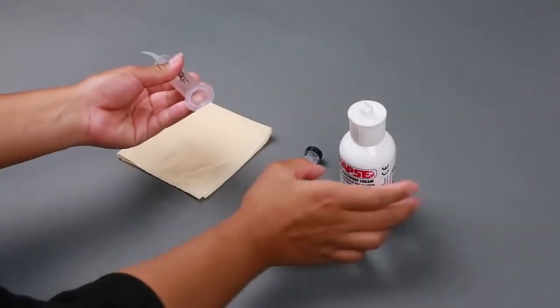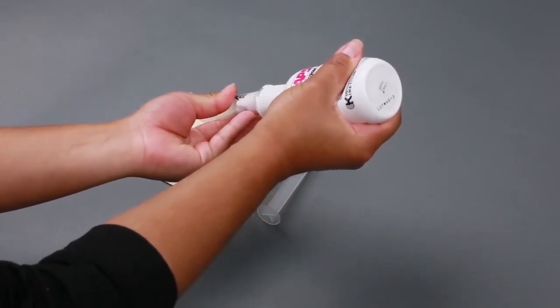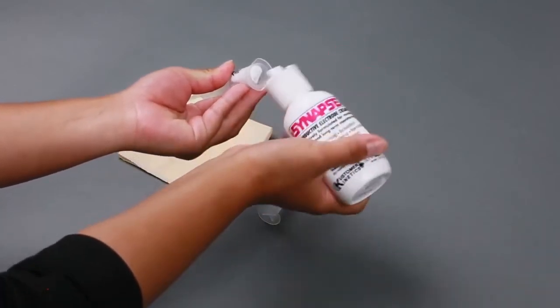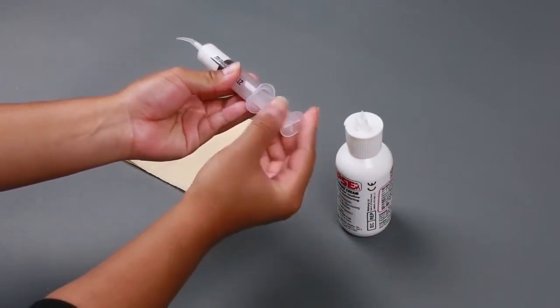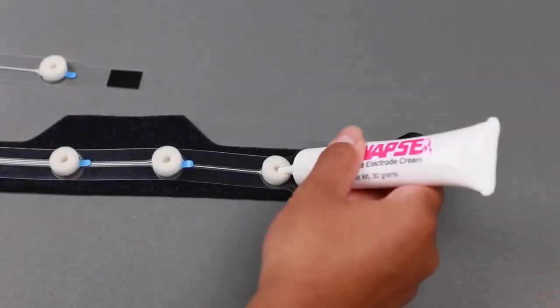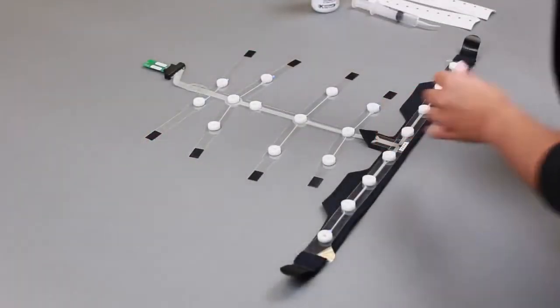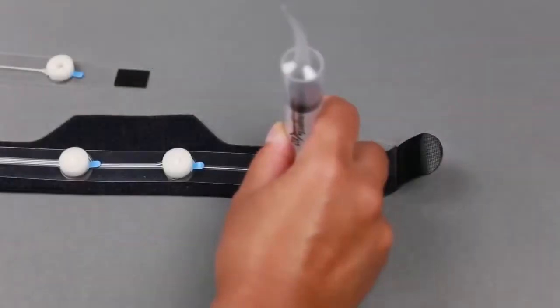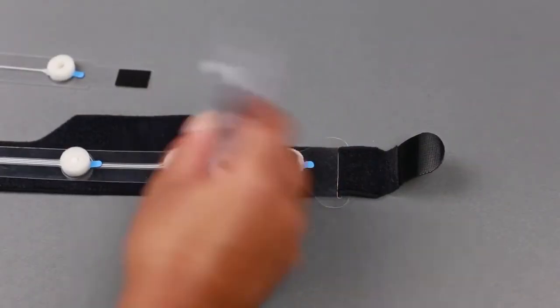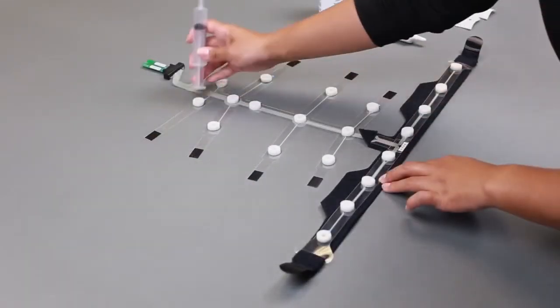Fill the cream application syringe with Synapse Cream using the 5-ounce bottles. The syringe should be filled approximately halfway. Insert the plunger and remove air for cleaner applications. An efficient way to manually prep foam sensors is to first fill the centers of all 20 sensor sites. With the flat surface of the syringe, gently press on each sensor site to allow sensor foams to absorb as much cream as possible. Refill the center of each sensor site and repeat these steps one to two more times.